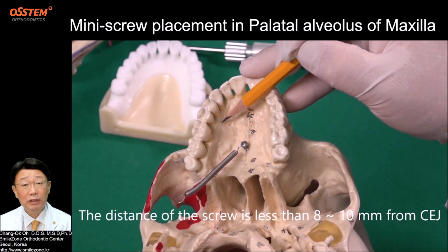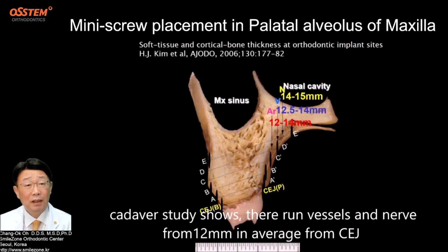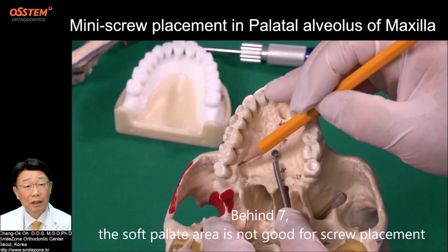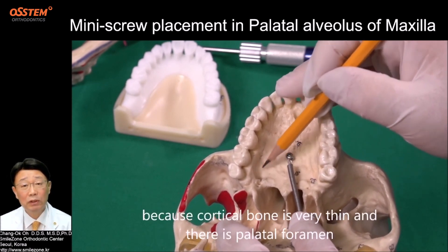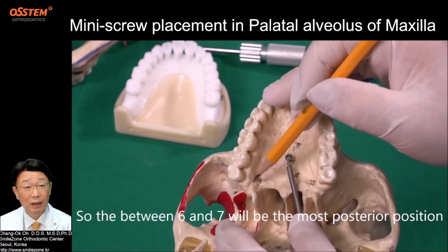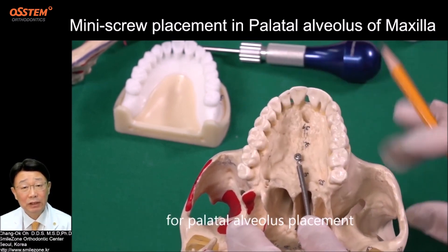The distance of the screw is less than 8 to 10 mm from CEJ. A cadaver study shows vessels and nerves run from 12 mm on average from CEJ. Behind 7, the soft palate area is not good for screw placement because the cortical bone is very thin and there is a palatal foramen. So between 6 and 7 will be the most posterior position for palatal alveolus placement.